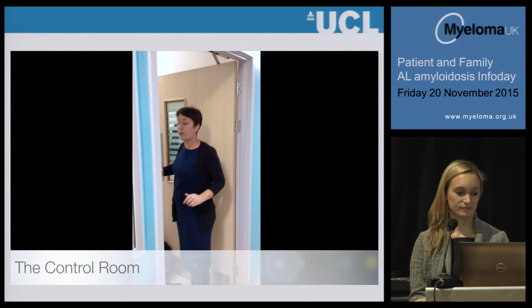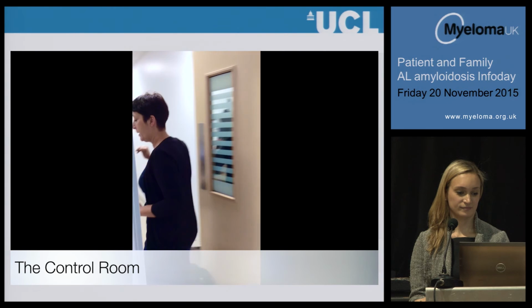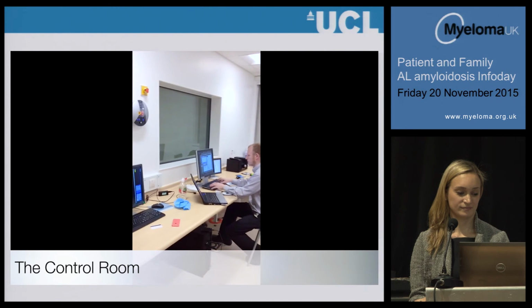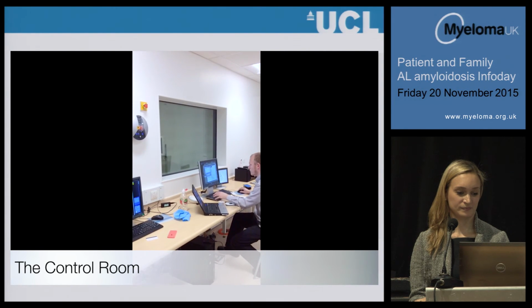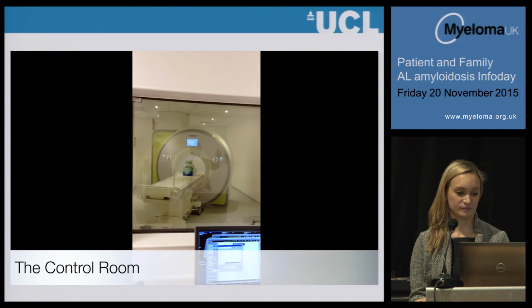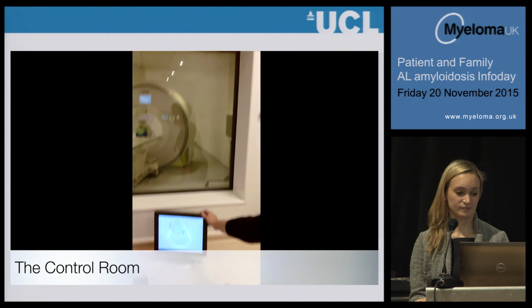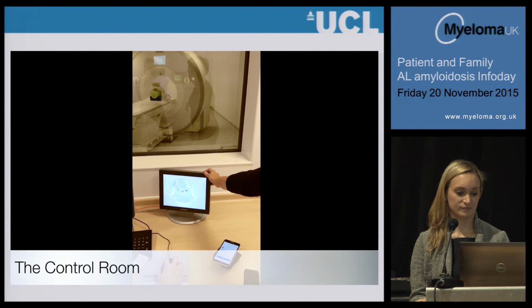In our control room we have a camera on you for the whole time, so you're always monitored. And a nice big clear window so that we can see you and observe that you're okay throughout the scan. And here is a monitor which shows us the other end of the magnet so that we can see you throughout.